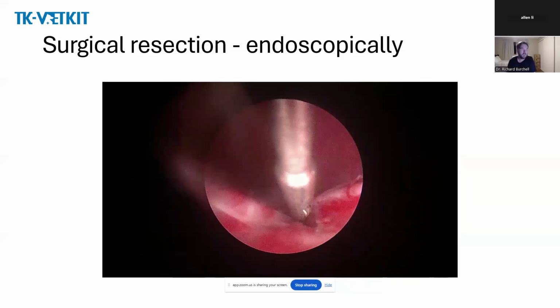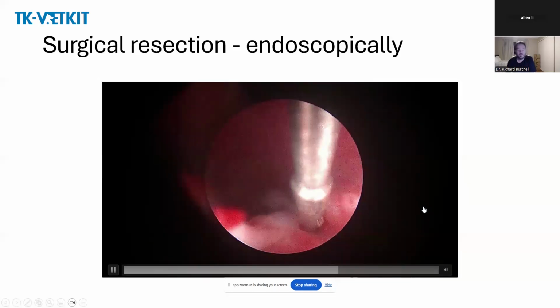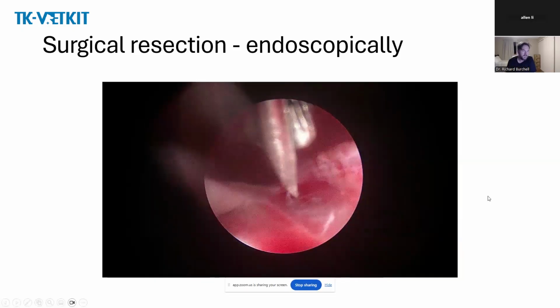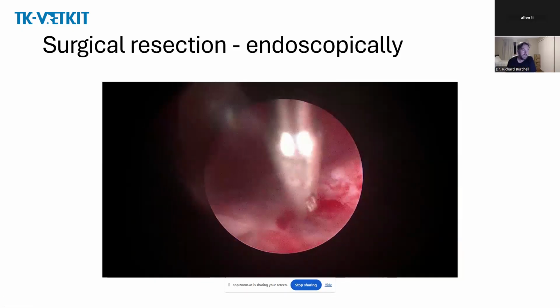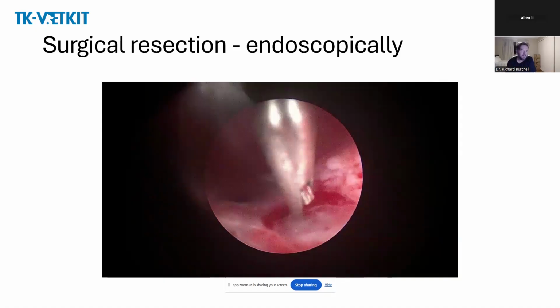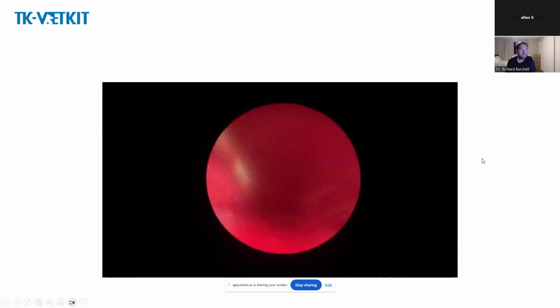Okay, so this dog is fully continent. I've done another one. This one I did months ago. I did another one quite recently, also with scissors, and it was a bilateral, also a golden retriever, and that dog is like 95% continent. So it's significantly improved. So this is a useful little technique.